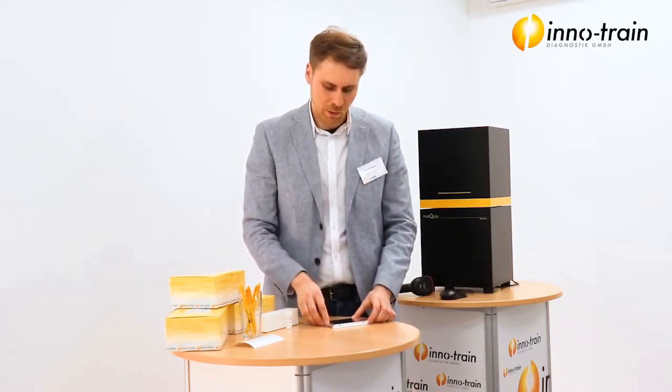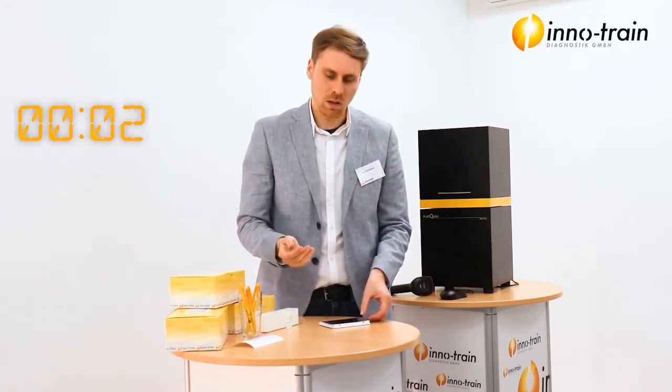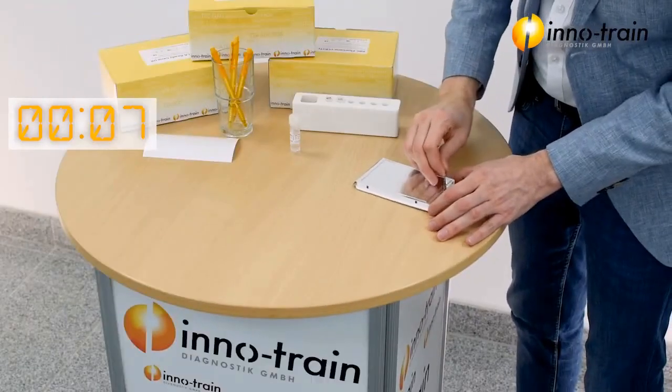I'll live demonstrate it now here, and I also will track the time over here so you can see how long you have hands-on time. First step, we will remove the sealing foil.